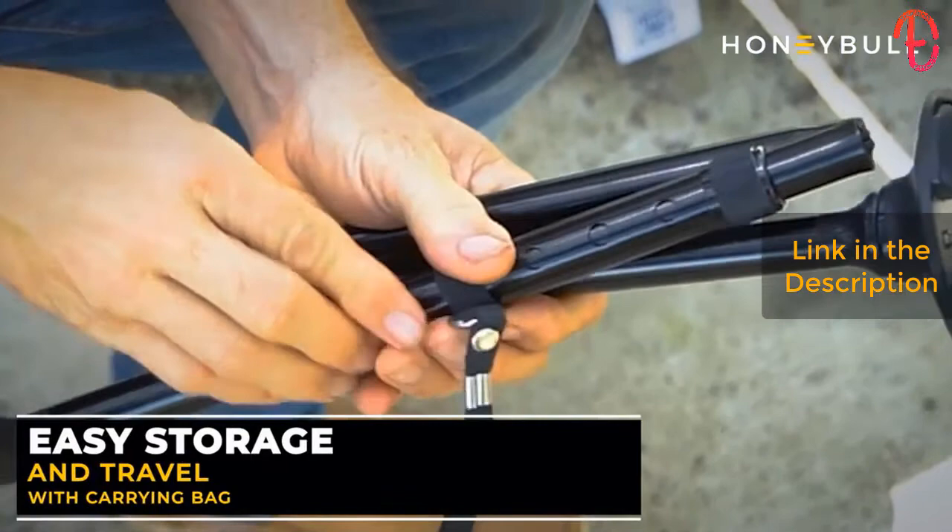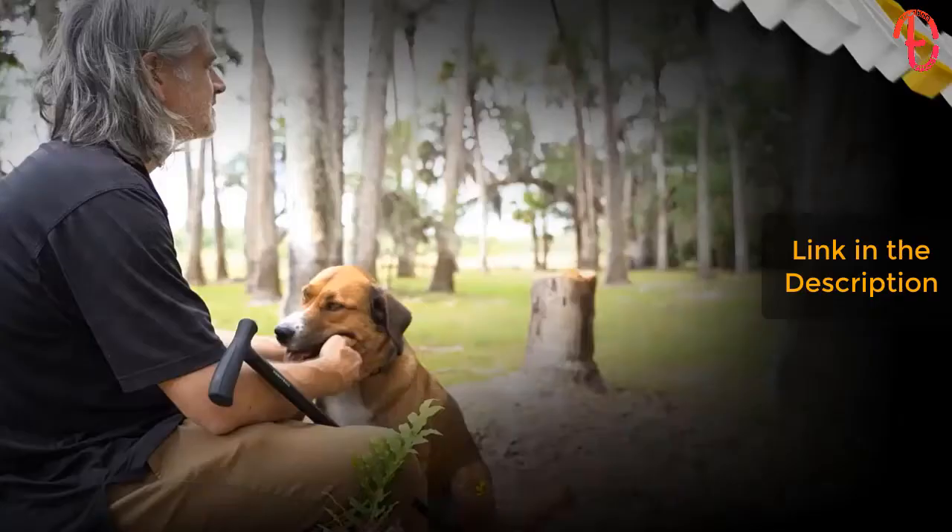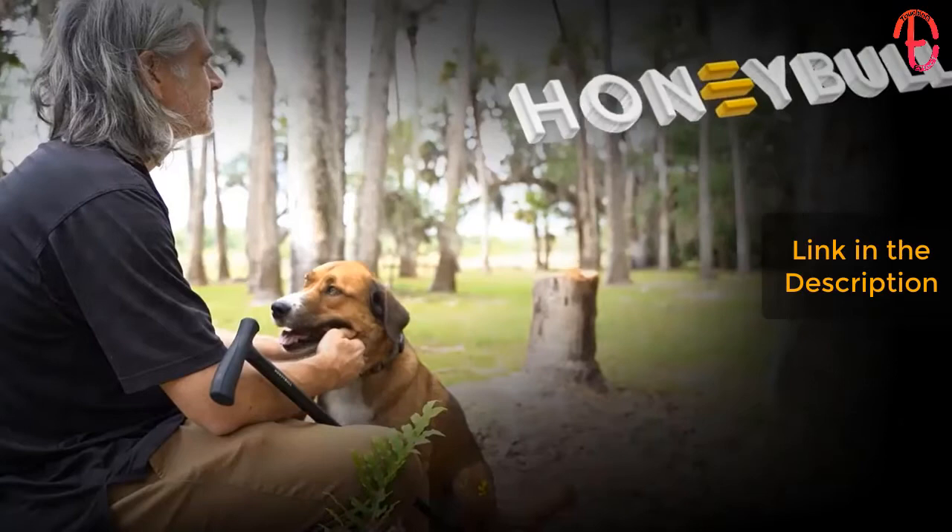The pivoting tip base rotates to stay flat, providing maximum ground contact. Storing and traveling with your walking cane is just as easy as assembling and fits perfectly in the provided carrying bag.